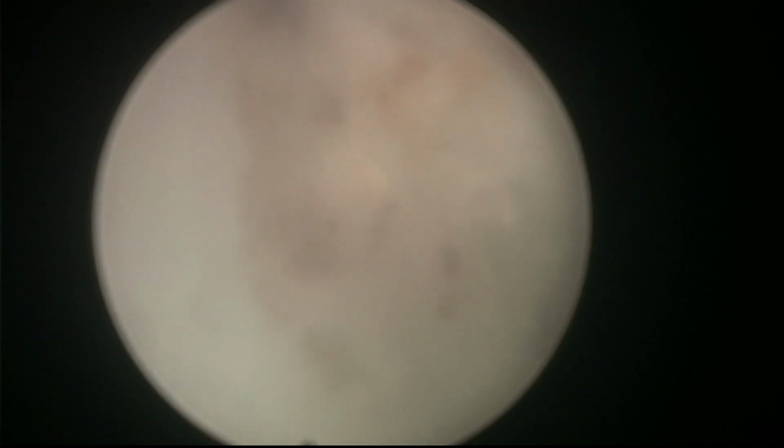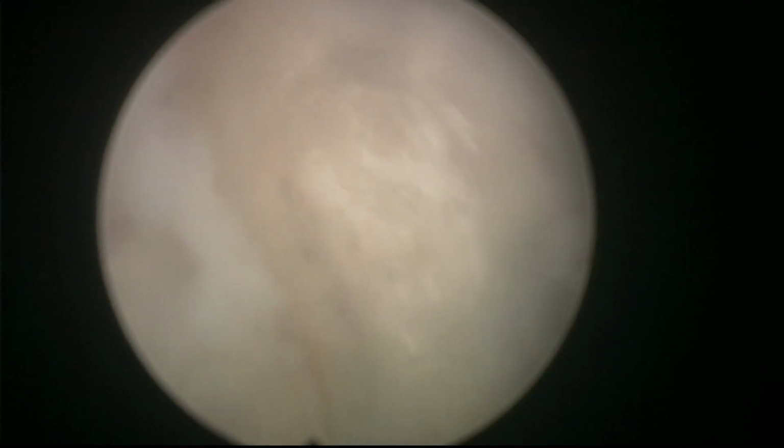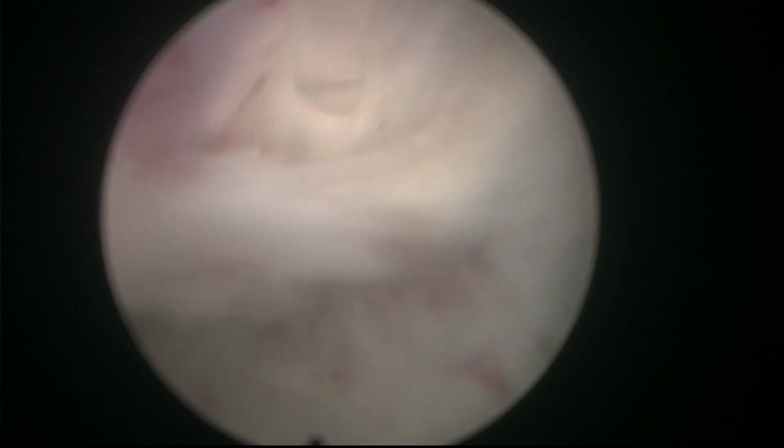So of course, trying to liberate here. Initially, I like to dissect the posterior apex a little bit, so we gain access and we gain the mobility of the apex. So the apex is more mobile, and then we can push it a little bit more medially to enter also the anterior plane. Now also here, you see, I like to connect the line of dissection in the lateral plane to the posterior plane. So we could follow this line, you see, from the posterior dissection to the lateral dissection without any big step.